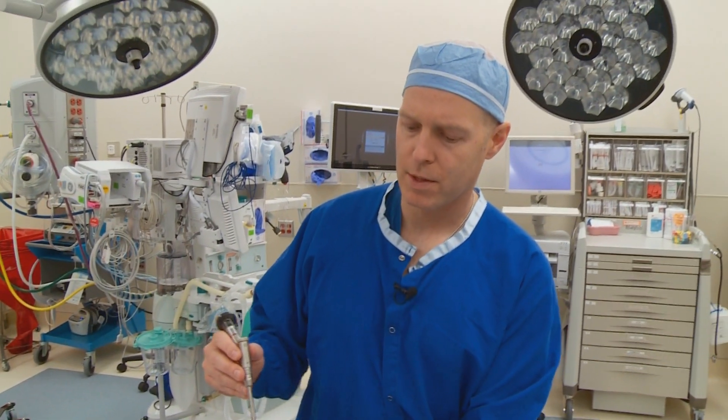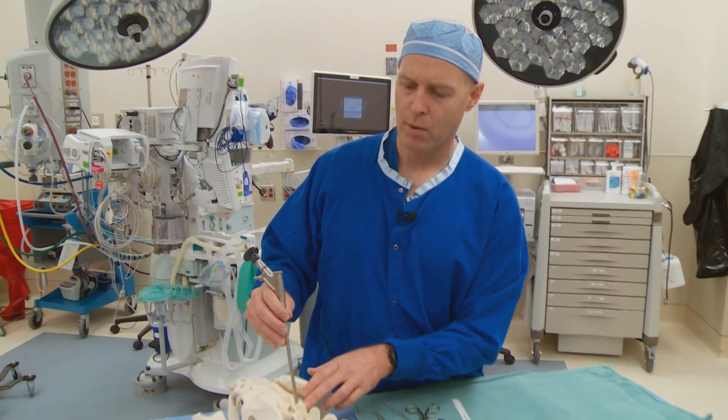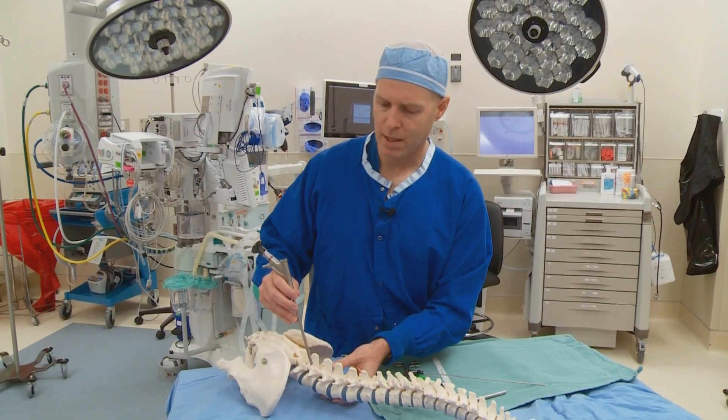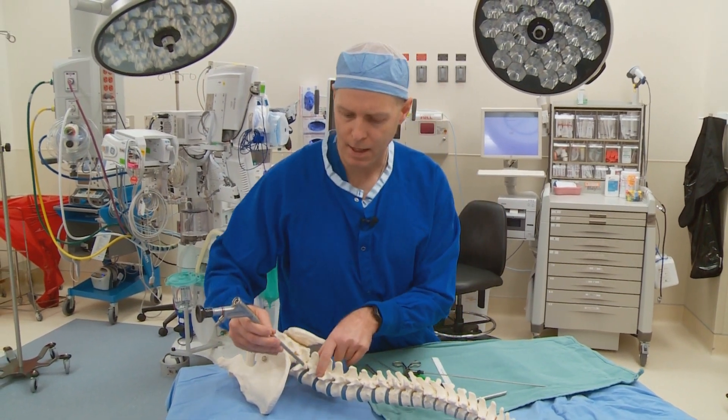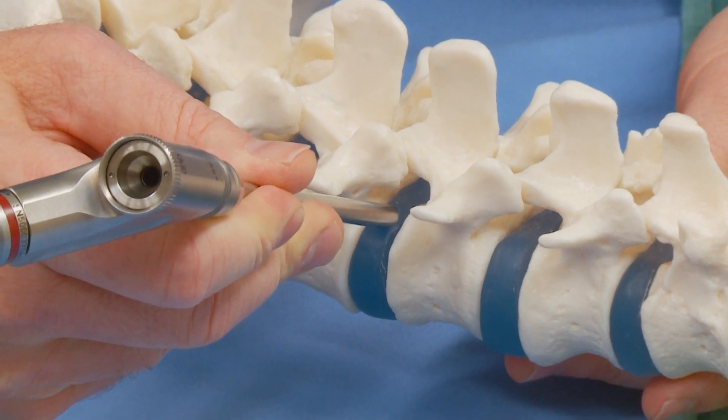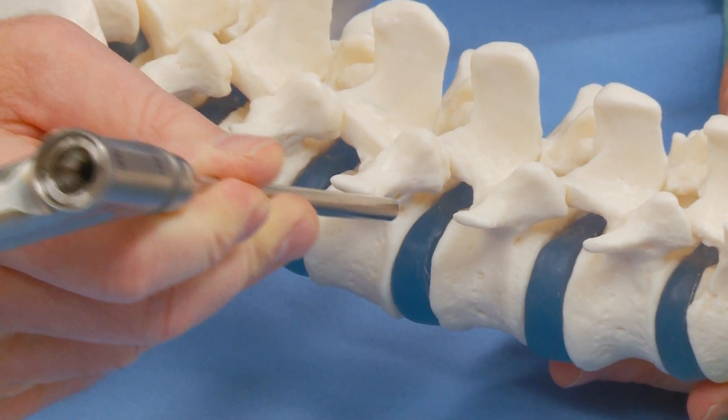There are two different ways that we do this approach. We do one where we work down the center of the spine — that's called the interlaminar approach — and then another one where we work off from the side, that's called the transforaminal approach, and that allows us to get in just underneath the nerve as it crosses by the disc there.